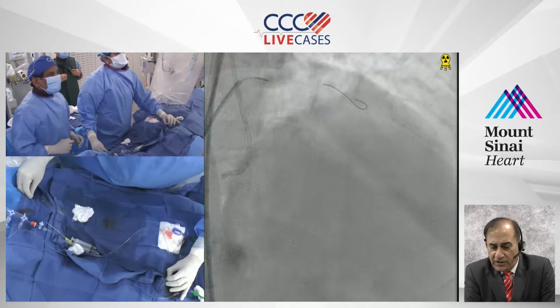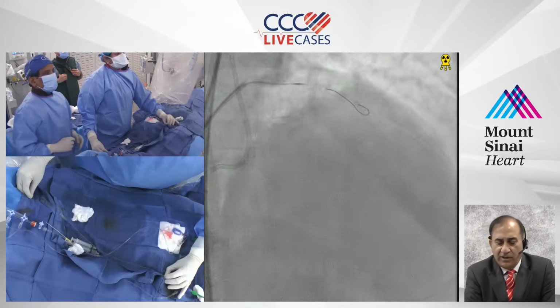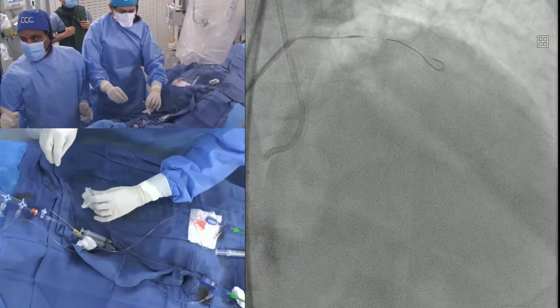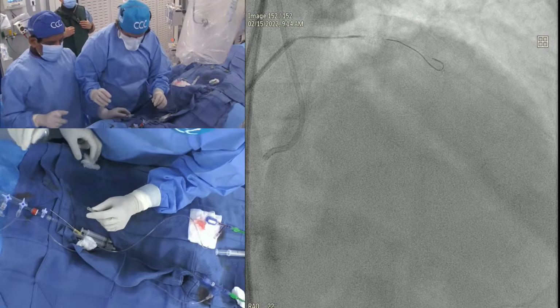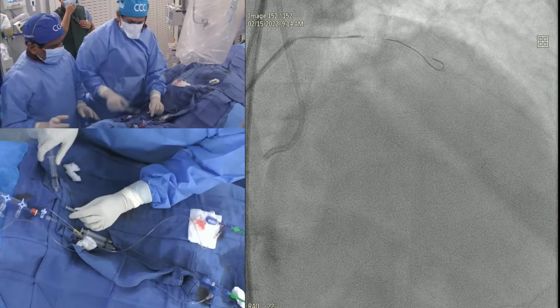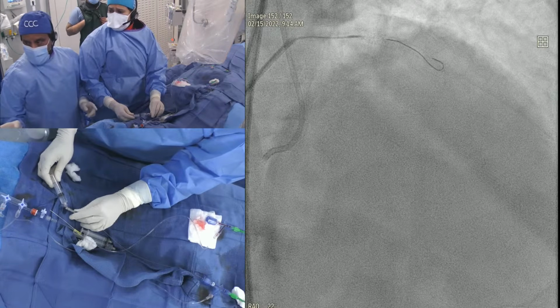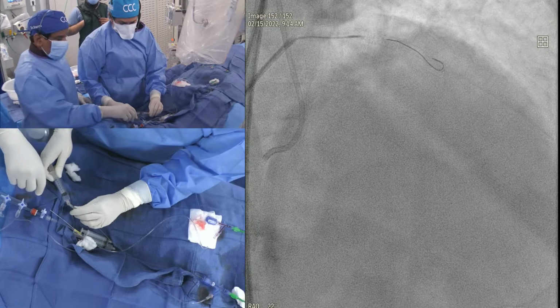I mean, here is a question. Try with the third septal and Corsair, Cyan black or Cyan blue. I don't think we carry the black. We may have. What do you need now? Take the wire. I just need the Fielder. We have the Fielder XC and FC. Get me FC. Okay. All right.